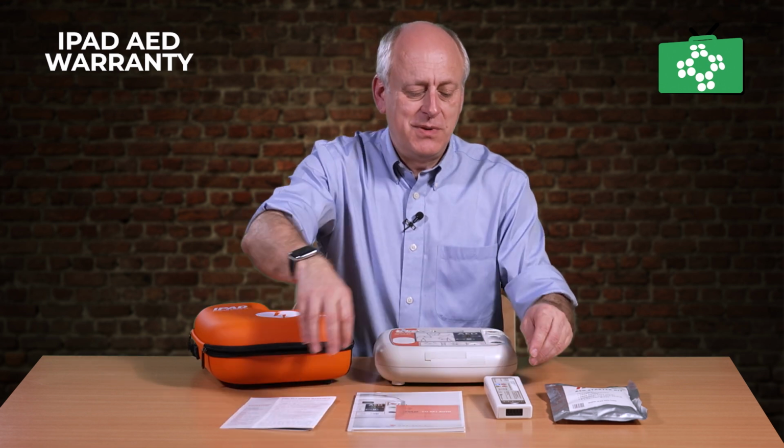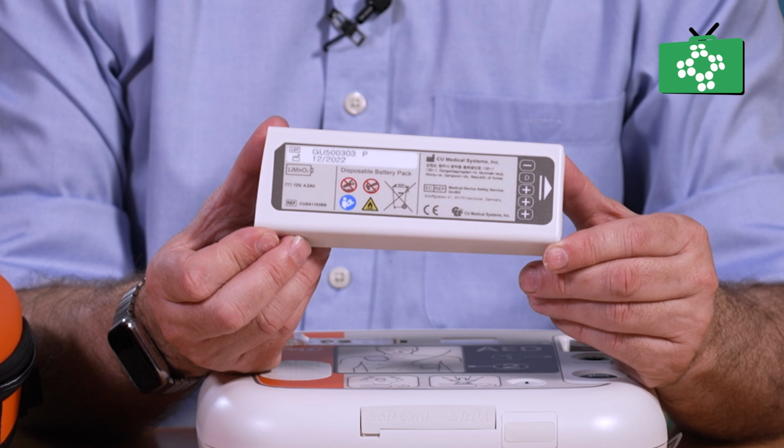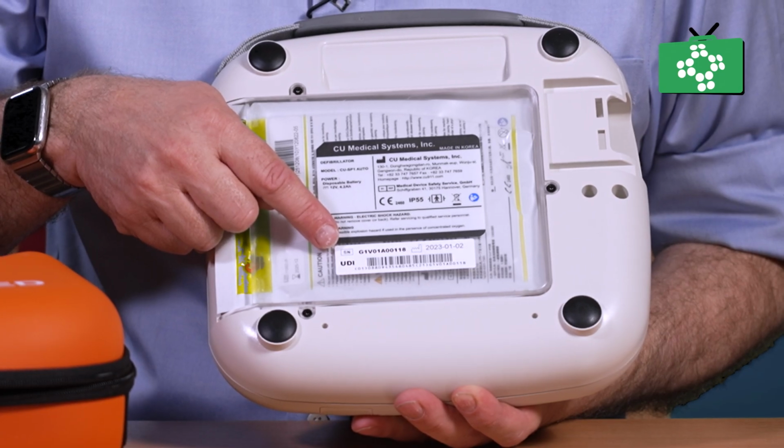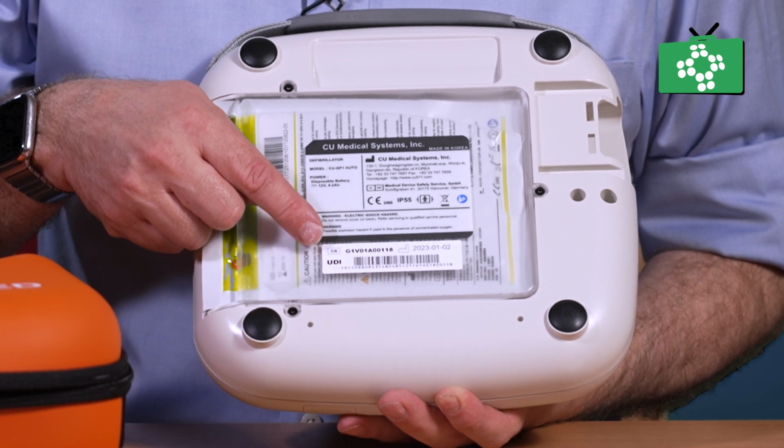You can find the serial number of the battery straight on the unit. On the front, you'll see the serial number clearly on there. And if you turn your iPad AED over, you'll see on the back there is the serial number as well that you can register onto the warranty.